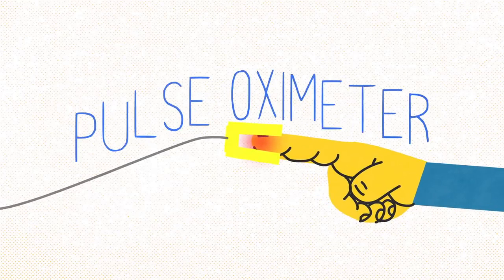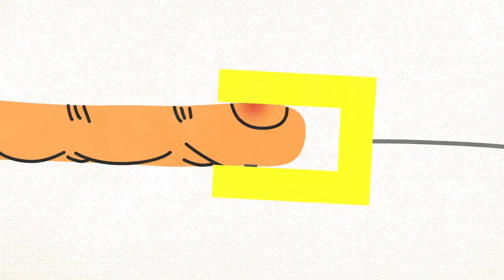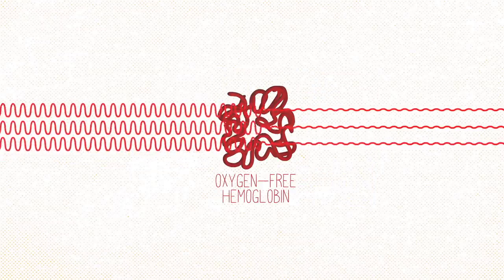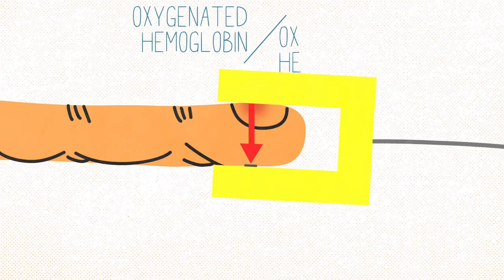It's called a pulse oximeter. When you inhale, your lungs transfer oxygen into hemoglobin molecules, and the pulse oximeter measures the ratio of oxygenated to oxygen-free hemoglobin. It does this by using a tiny red LED light on one side of the finger clip and a small light detector on the other. When the LED shines into your finger, oxygen-free hemoglobin in your blood vessels absorbs the red light more strongly than its oxygenated counterpart. So the amount of light that makes it out the other side depends on the concentration ratio of the two types of hemoglobin.